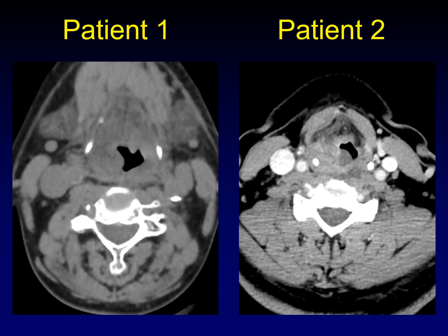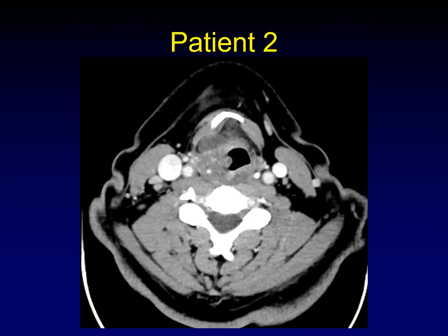Does that help to narrow down your differential? Here's another picture of patient two that might be helpful. You can see that in addition to the ill-defined enhancement throughout this lateral aspect of the larynx, you can also see a cystic area — a saccular cyst that accompanies the rest of this inflammation.